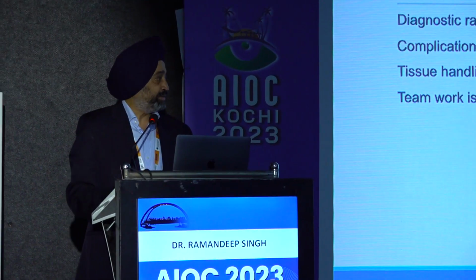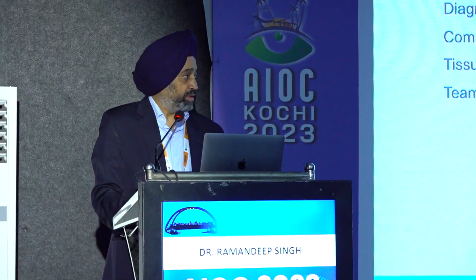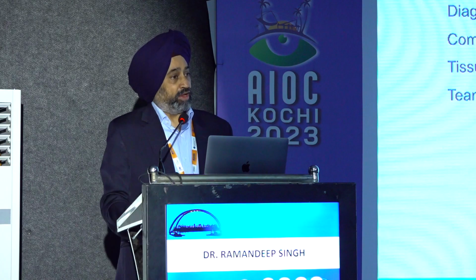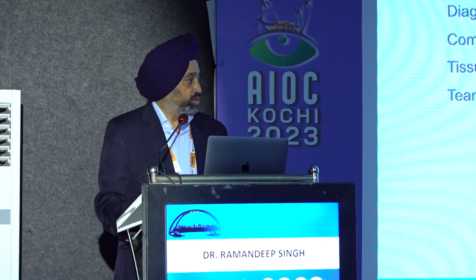But what is your current indication for chorioretinal biopsy? Is it the infective and malignancy part, or anything else? Sorry, sir, what is your indication for chorioretinal biopsy? It's infective and masquerading, obviously malignancy. Yes, these are the two indications which are there.